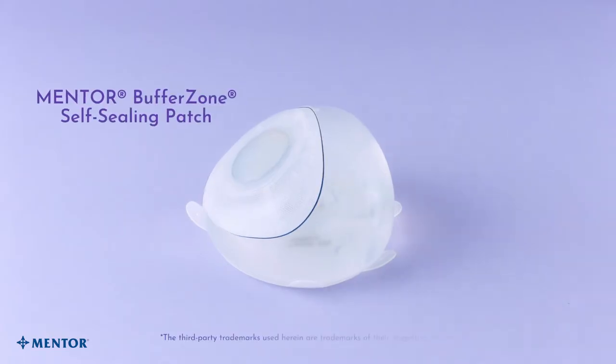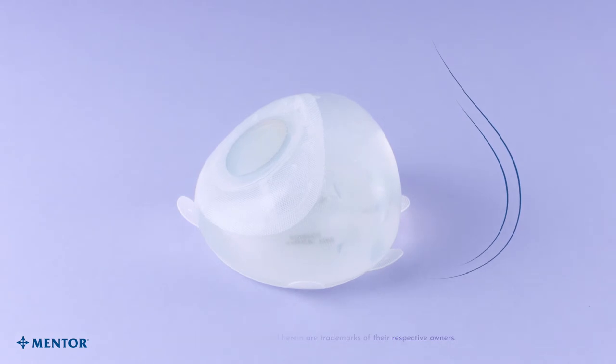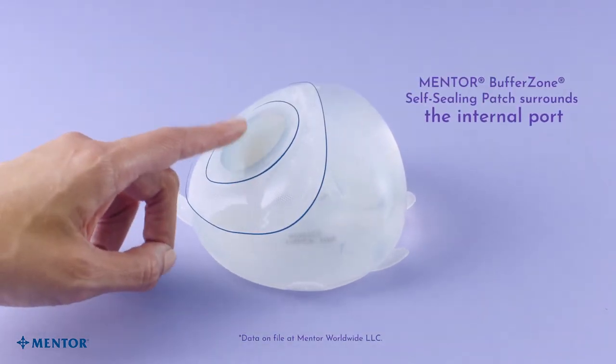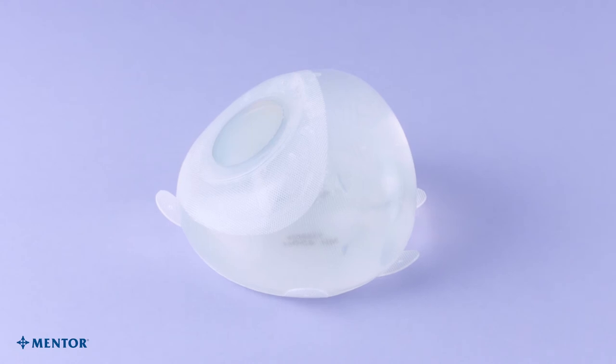The proprietary Buffer Zone Self-Sealing Patch and the Dacron Patch drive lower pole expansion to mimic the shape of a natural breast. The proprietary Mentor Buffer Zone Self-Sealing Patch surrounds the internal port and helps protect at least 50% more surface against accidental needle puncture and expander deflation during post-operative fills.